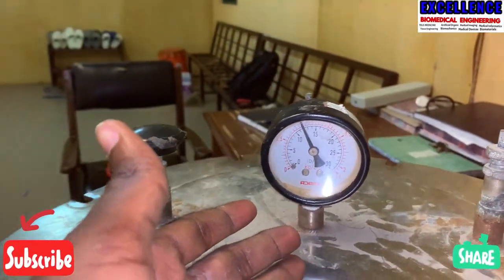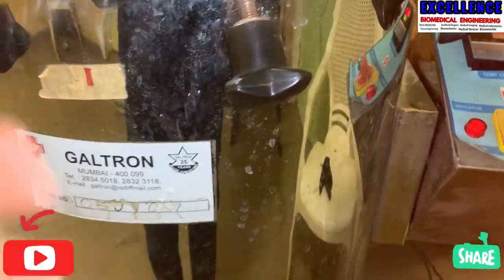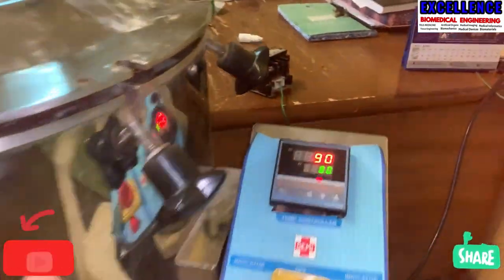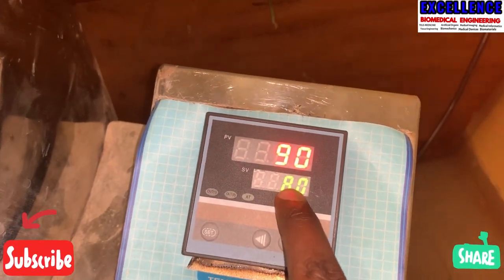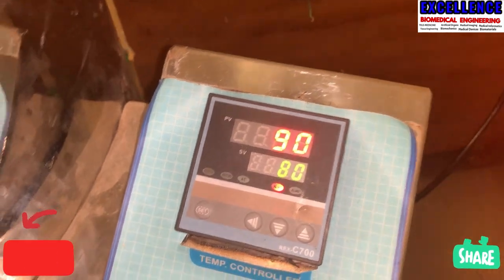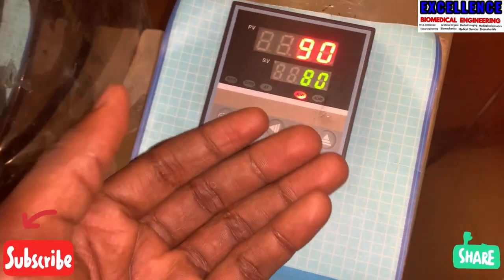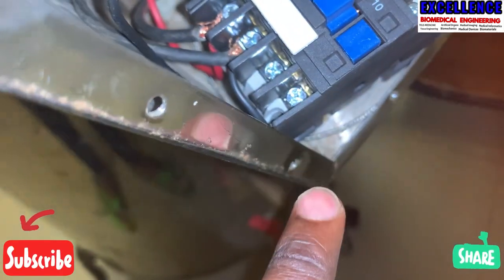This is a temperature controller and this is a switch. Here we have the pressure gauge, which measures the amount of pressure being generated after the element has heated up. The temperature controller controls the desired temperature — once the element heats up to about 90 degrees, the controller switches it off, and once it comes below 80, it triggers the electric contactor to turn back on.